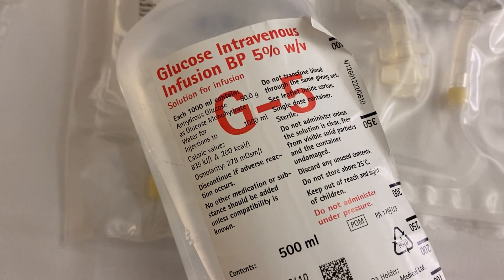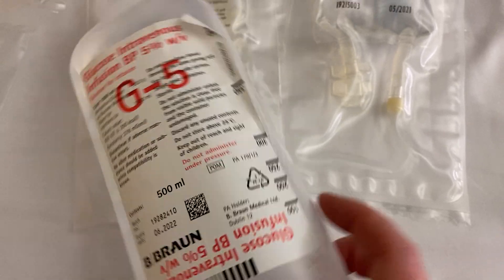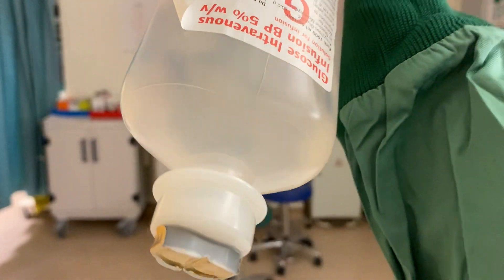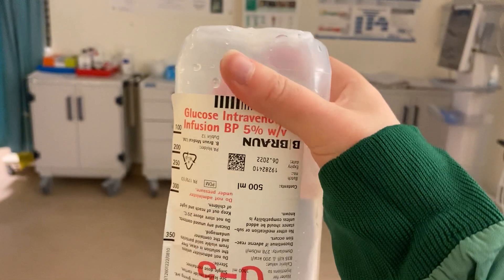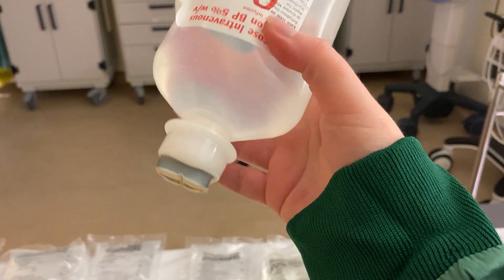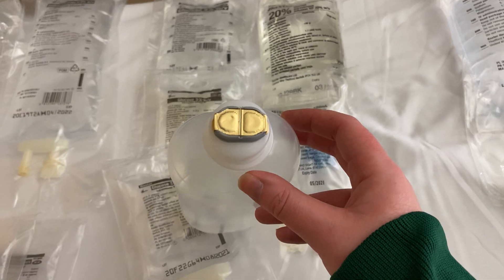5% glucose is also available in 100 ml and 50 ml bags, and in a 500 ml glass bottle format which also shows calorie content. These bottles hang upside down — the numbers on the side tell you how much has drained. Pull off the foil and spike the hole underneath to use them. If a glass bottle isn't draining, insert a wide-bore needle through the other side to allow air in and let the fluid drain down through the giving set.